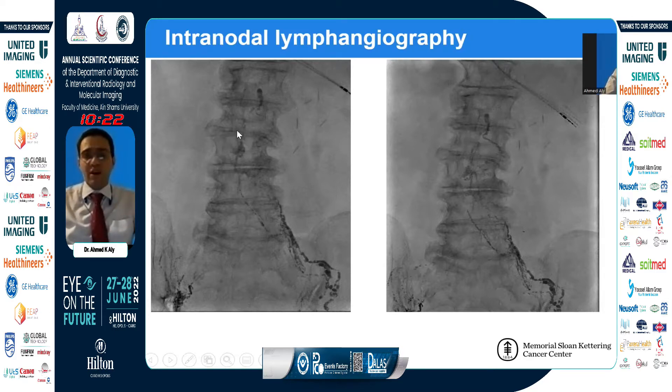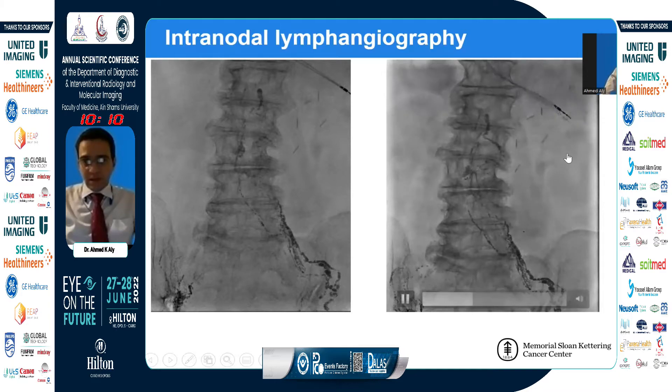In cases of thoracic duct leaks, we want to opacify from both sides. But if we have a unilateral lymphocele or suspect a unilateral leak, we can go through a unilateral access only. This is a fluoroscopic loop showing how the cisterna chyle can look — this is actually a very nice, easily accessible cisterna chyle.